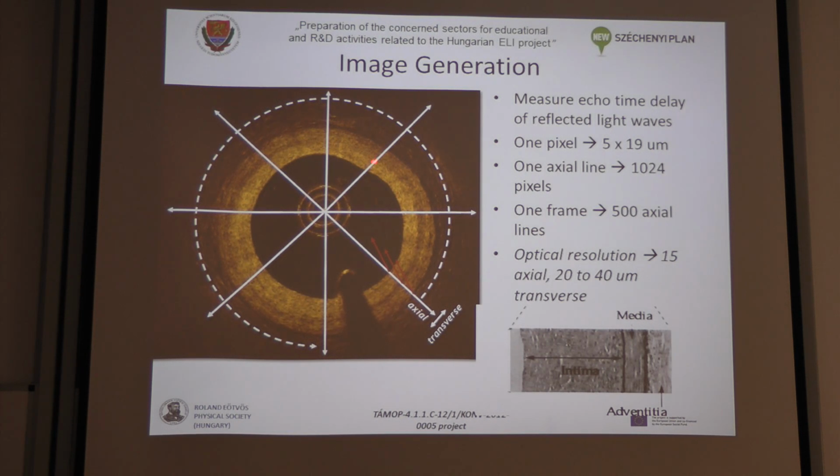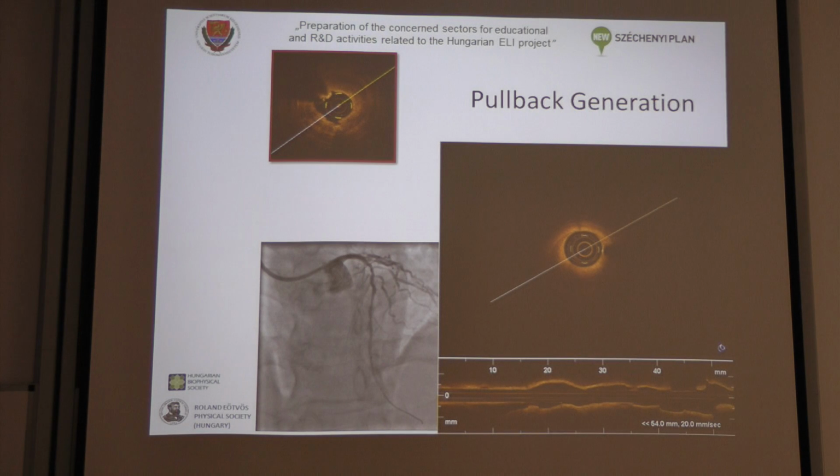You can see on this cross-sectional image that the transverse resolution is also very good. You know, you can, let's say, describe to yourself all these pixels and all these things that were listed on this.